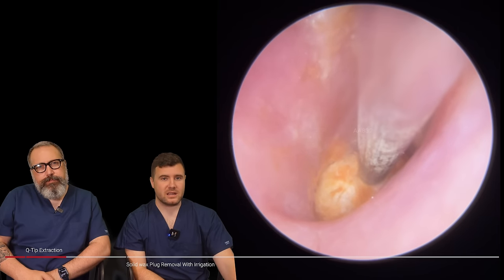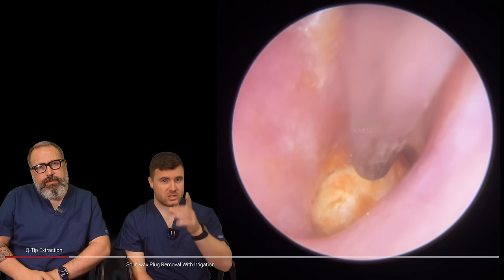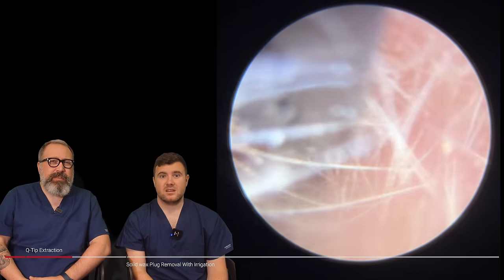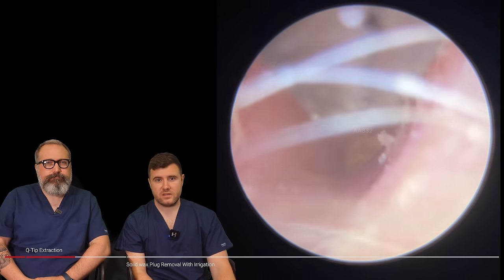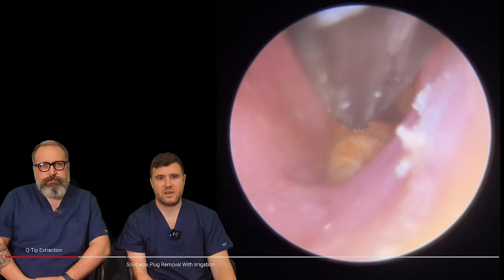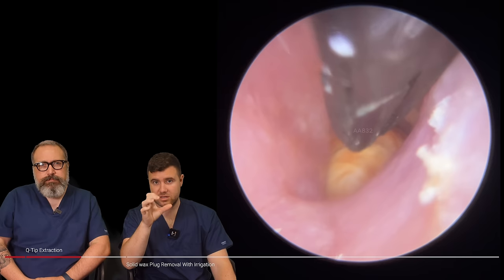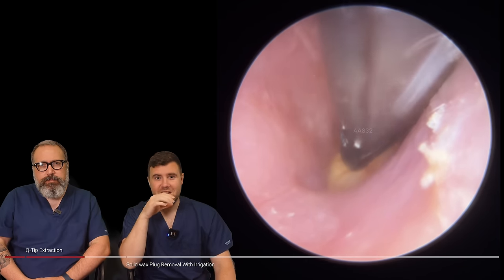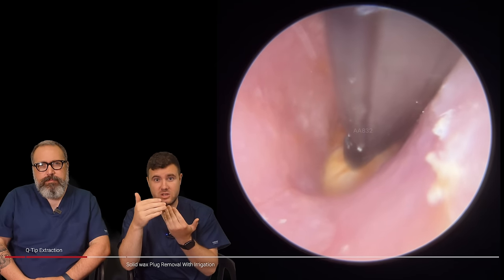This is more than likely not going to go anywhere at all with suction — sometimes we're lucky. This looks like it's been there a long, old while, just sitting there absorbing water and oil and everything else. You can just slightly see a portion of the eardrum above the cotton bud. But the patient's only recently been having issues with the hearing. This is a very tricky one — the forceps are tiny, and you can see how much space we've actually got to work with here, which is next to nothing.